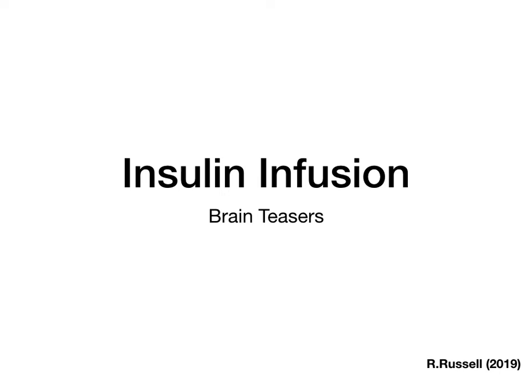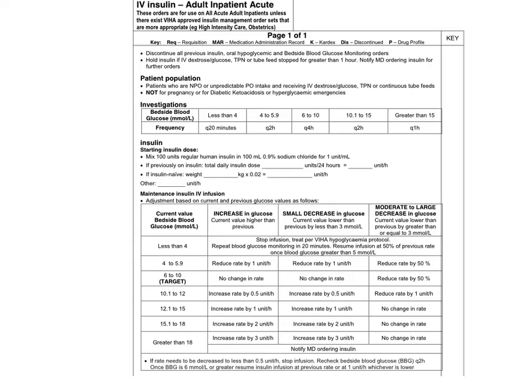This is a supplemental video to help with learning about insulin infusions using Island Health's IV insulin adult inpatient acute clinical order set. When we take a look at the clinical order set, we can see the orders that actually can tell us how to start and mix the insulin.